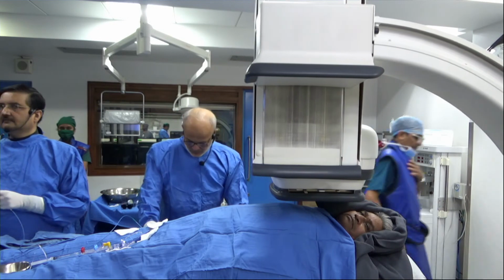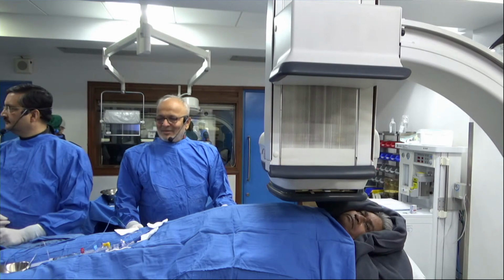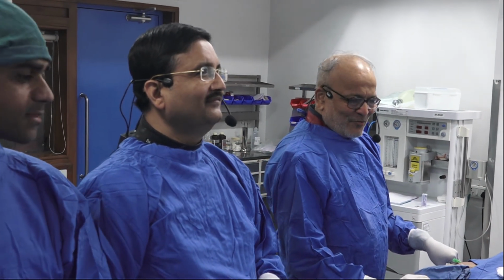Hello. Dr. Patel, you're on. Yeah, lovely. So, am I audible? Yes, Tejas. We can hear you. So, what do you think? It looks very unfriendly. Unfriendly. What looks unfriendly, the lesion or the loop? I think everything. So, we try to make it friendly. No problem. Let us see.